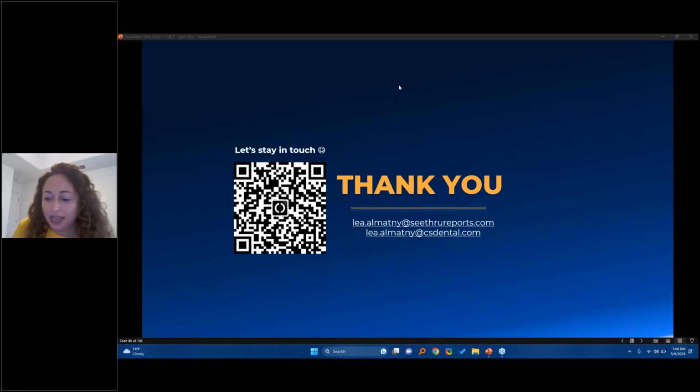But I would say 90 kV and 8 mA or 10 mA, or 120 kV with 8 mA, depending on if you have the 120 kV option. When it comes to the voxel size, it also depends on why you're taking the scan. I don't want you to take a high resolution scan on every patient, but you do have that option if you need to.